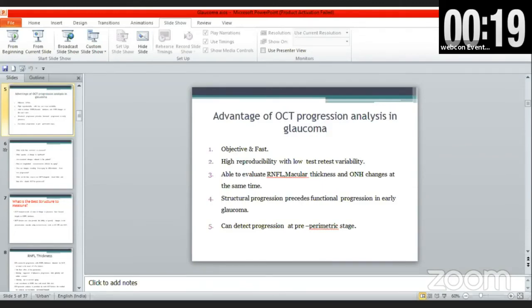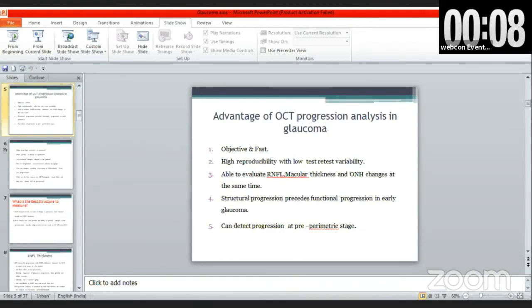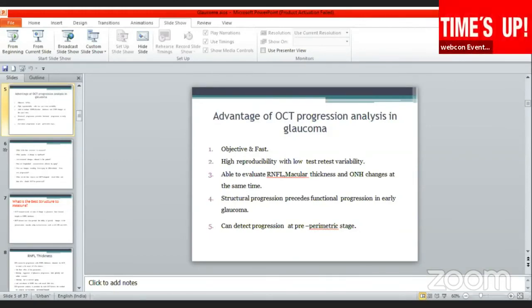This is a swept-source OCT from a Topcon machine, showing circumpapillary RNFL thickness, with the thickness line sometimes going beyond the normal range. The RNFL thickness view and GCL/IPL thickness view are shown alongside progression plots, from which we can see changes that have occurred and progression likely to continue in the glaucoma patient.